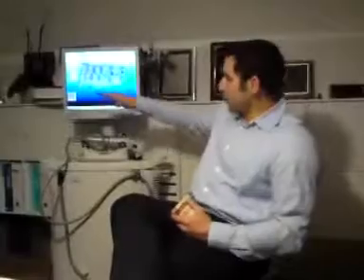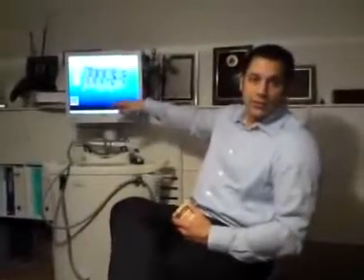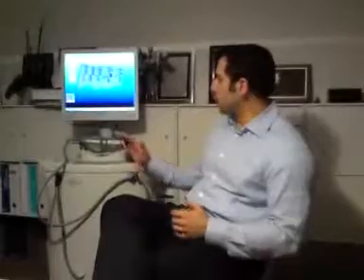Mm-hmm. So the lab has the ability to make final edits to the prep design. So before we mill the model, we'll mill it to the lab's final edit. And the reason why they have the final edit is because they're the ones responsible for making the crown. And if the crown doesn't fit and the doctor had the final edit, then the hands will be pointing this way, and the lab is ultimately in control of what they're willing to warranty and back up. So that's the reason why we give that.